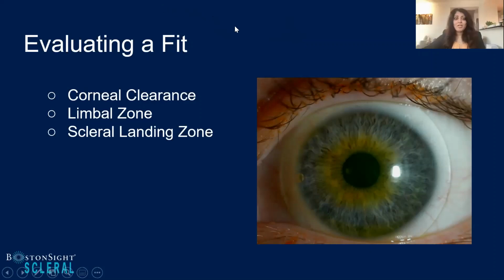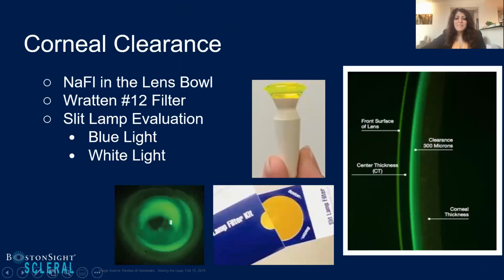It's funny how that philosophy has changed over time, as well as now the independent curves and the way they all work together independently, where you can change one curve, and when you make one change, the whole thing doesn't change. That's really changed the perspective on how we actually fit. Now, if we dive in and start looking at corneal clearance being the first thing that we look at, there are a couple of different ways that you can evaluate corneal clearance.